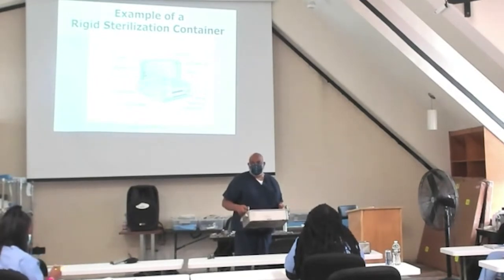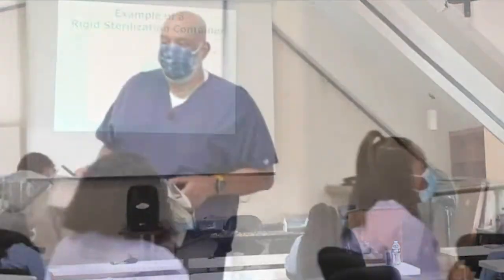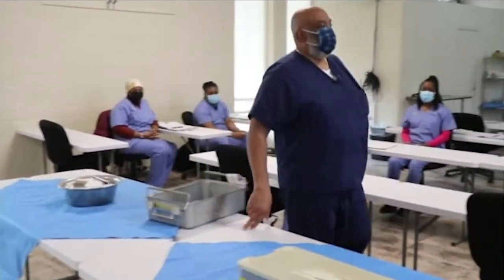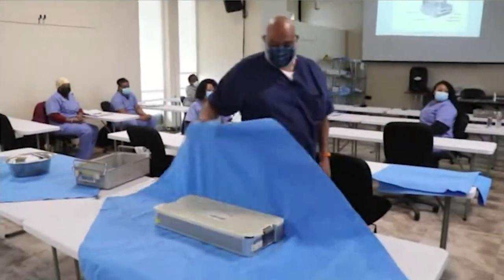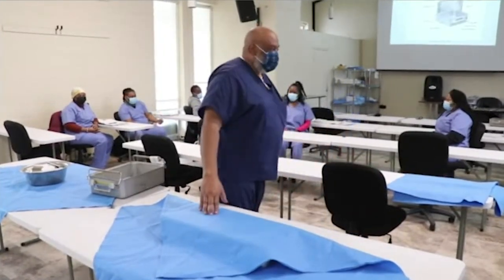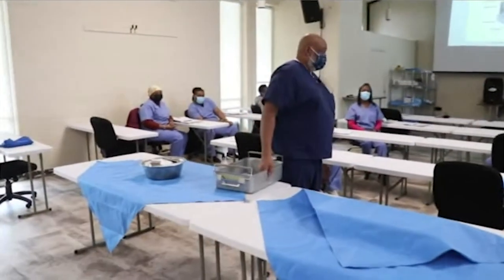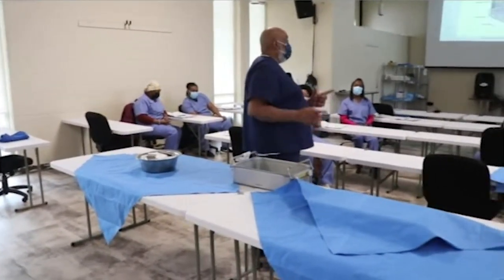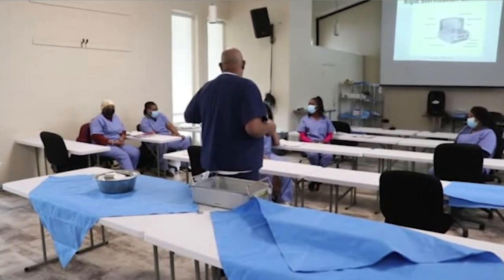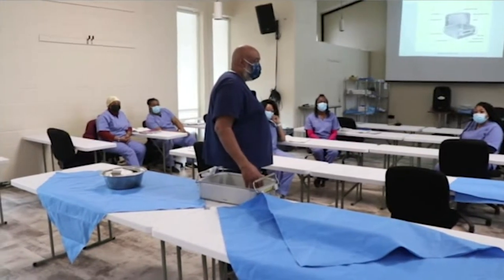Now let's look at our rigid containers versus our wrap instruments, and I have a question. Ronesha, you ready? All right, this is the side of the room. I can break y'all into three teams today. You have your wrap container, and I have my rigid container. It's got a lid on it. And I'm ready to load them up into the sterilizer. You guys are on steam today. You guys are prep and pack, and you are decon. 1, 2, 3. It's time for you to load the instruments into the sterilizer. Okay?